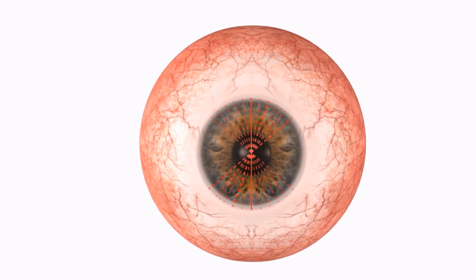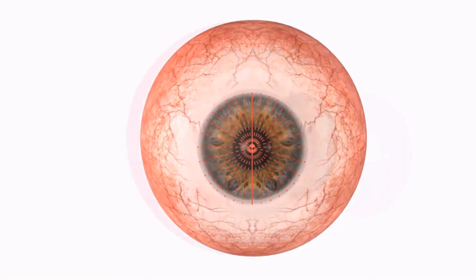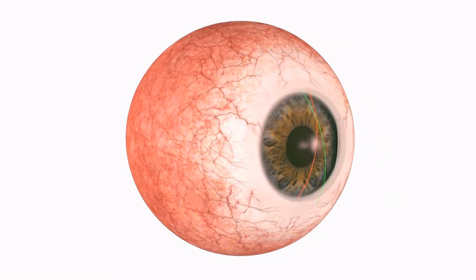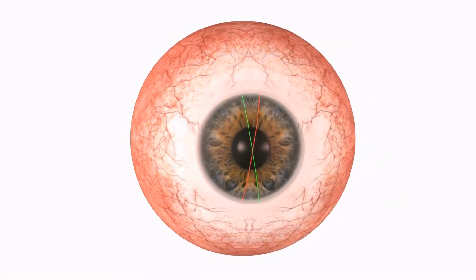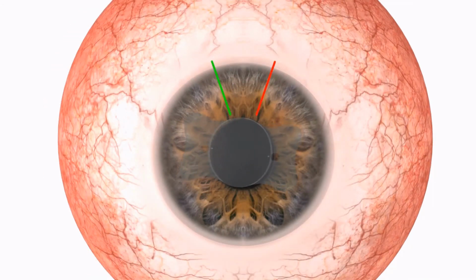Interestingly, the use of these statistics has often outperformed physical measurement of posterior corneal astigmatism when comparing outcomes from cataract surgery. We are now able to combine anterior keratometry with either a population average or physically measured posterior cornea to provide a value for total corneal astigmatism.